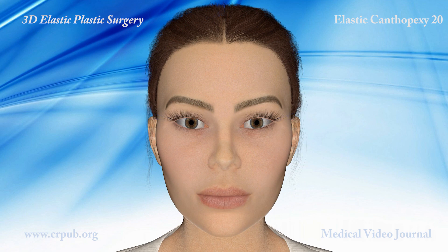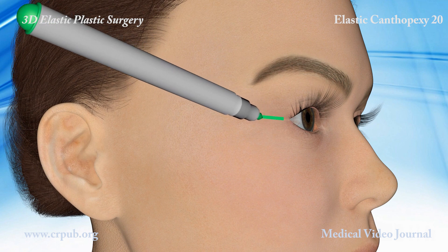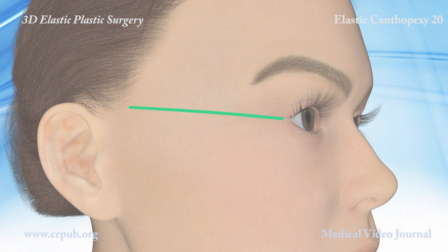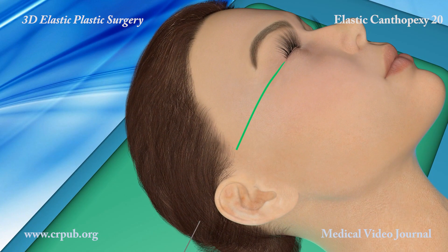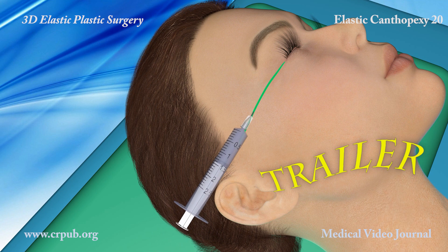A dermographic pen is used to draw a straight line from 0.5 mm from the external canthus to the hairline. This line constitutes the lower side of an isosceles triangle. Local anaesthesia is carried out along the implantation pathway of the elastic thread, elasticum EP4.